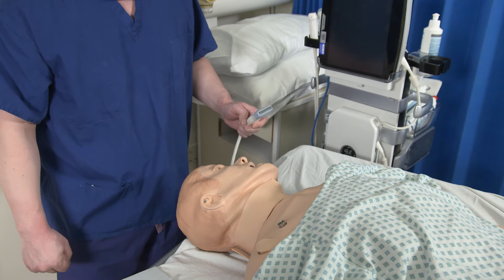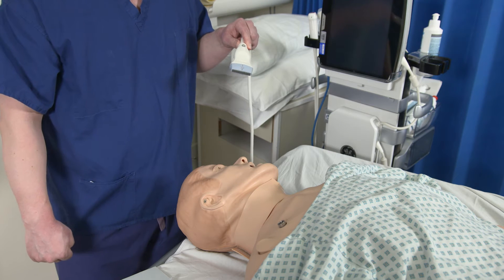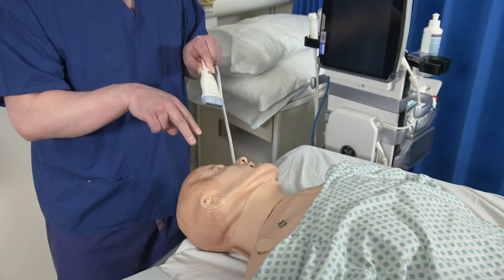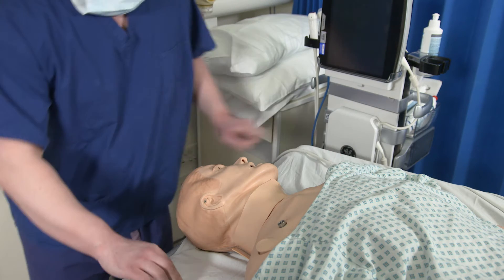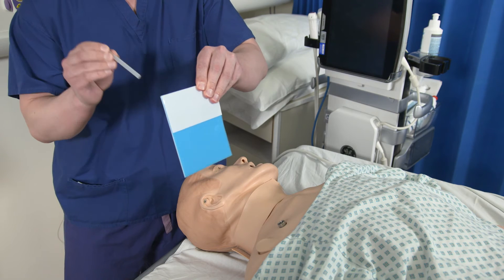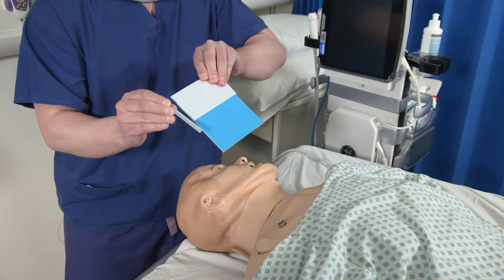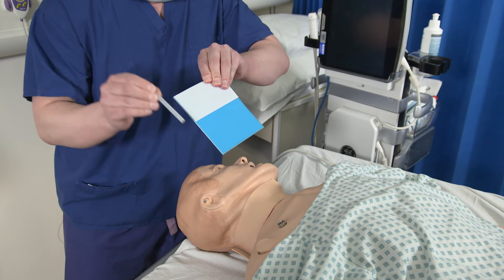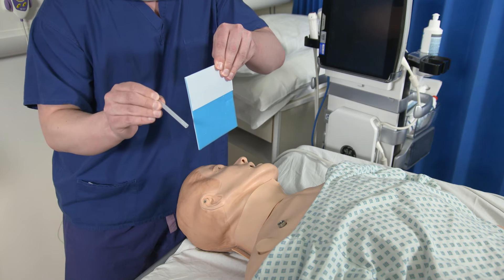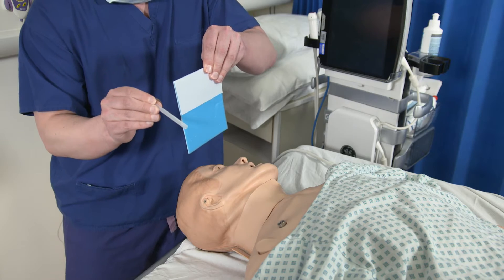One of the more difficult things about learning to do this procedure is getting to grips with the ultrasound. One of the most helpful things I was ever told was to envisage the beam coming out of it about the width of a credit card. If you have your beam running the same direction as your needle, you should see it all the way down into the vein. Whereas if you have your beam perpendicular, you will see a small bit of needle crossing the middle and nothing else except distortion in the tissues.